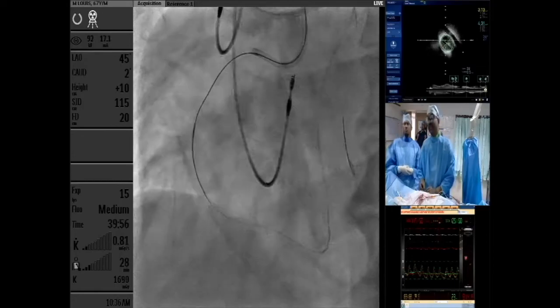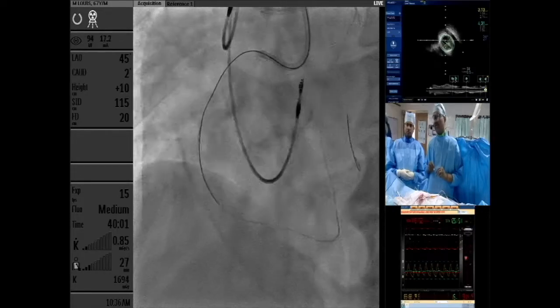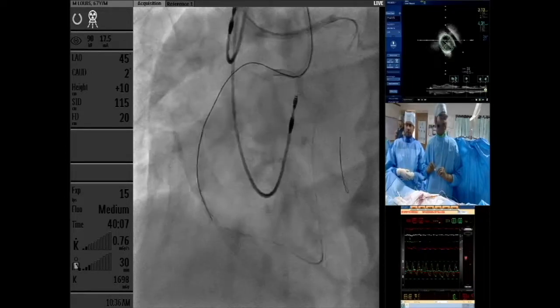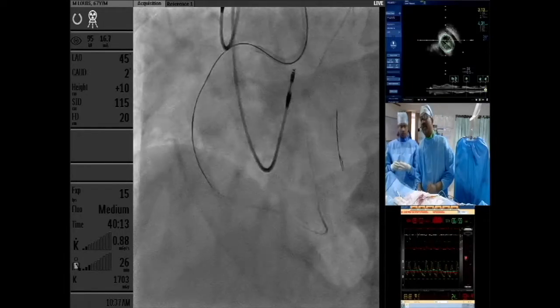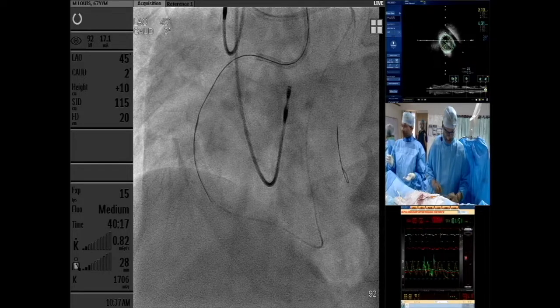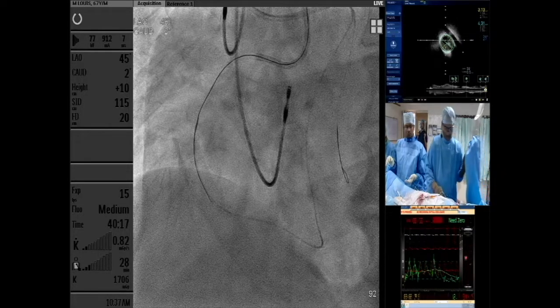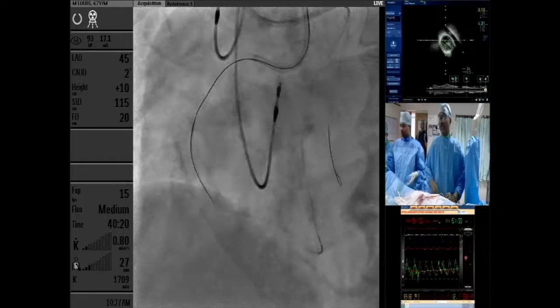But I think, okay, trapper 2.5, please. No, no, no. That never happens in such a big request. So I'm coming back with my antegrade Fielder XT-A. What I'll do is I'll take a guideliner and then we'll take a 1 mm balloon and then we'll try to dilate the lesion. And then we'll advance the microcatheter followed by IVUS and further procedure.